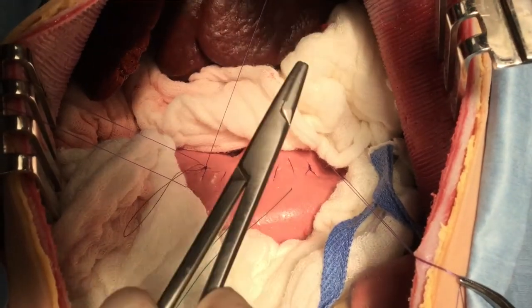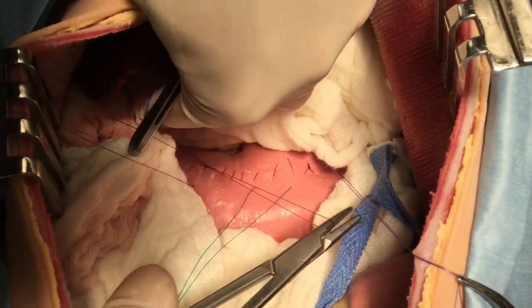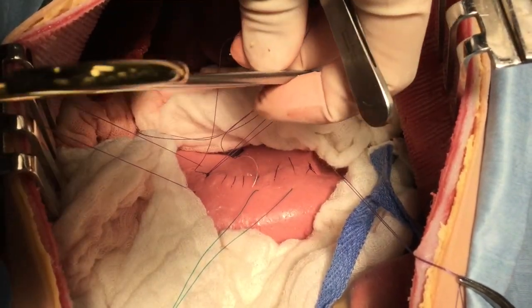The sutures are cut, stay sutures are removed, and that completes the procedure.